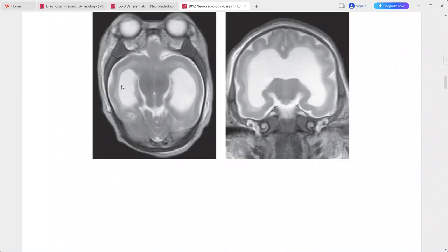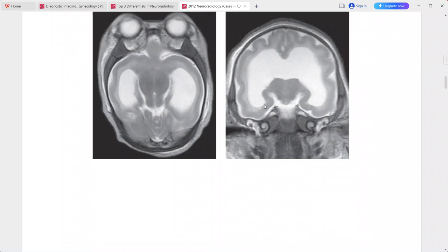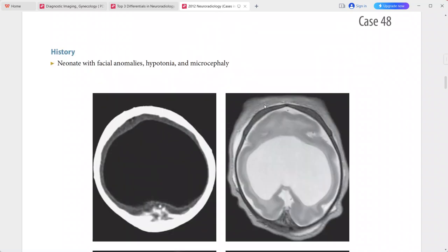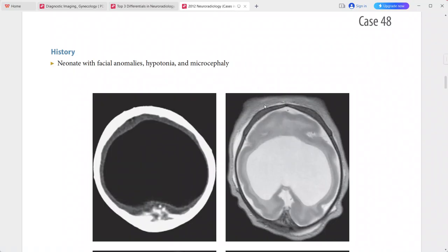There is fusion of the frontal lobes anteriorly and fusion of the thalami in the midline. This is a typical case of alobar holoprosencephaly. Differentials include severe hydrocephalus with ruptured septum pellucidum, hydranencephaly, large bilateral open-lip schizencephaly, and agenesis of the corpus callosum with large interhemispheric cyst.